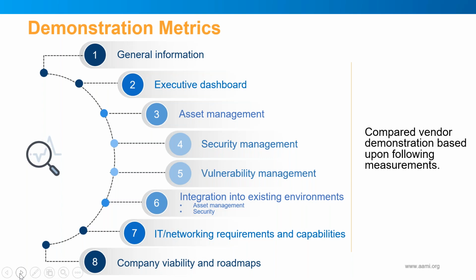So when we pulled the selection committee together, it was made up of people from Travis's clinical engineering department, the IT security teams, and IT networking. So we had a pretty broad scope of technical people in the room that would be able to evaluate and look at these. And we defined several metrics that were really important that we wanted to measure. Those would further get down to which is the easiest to use, provided the most information, and was going to hang around the longest amount of time.